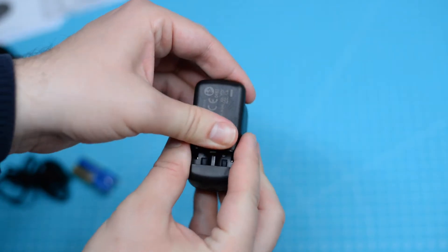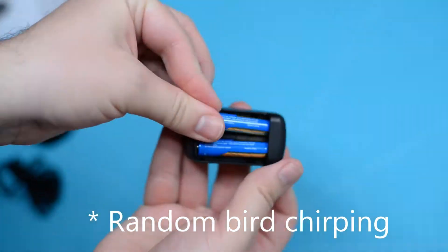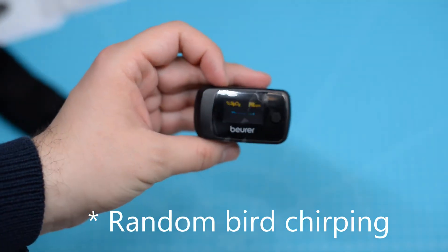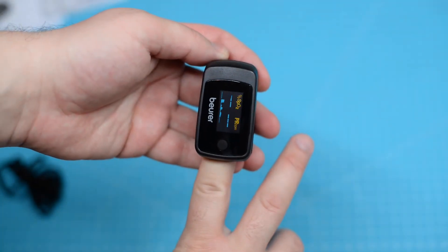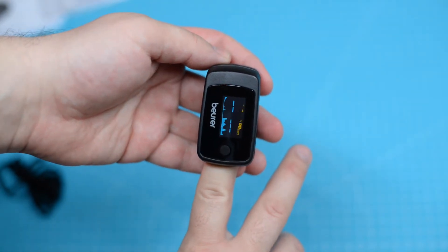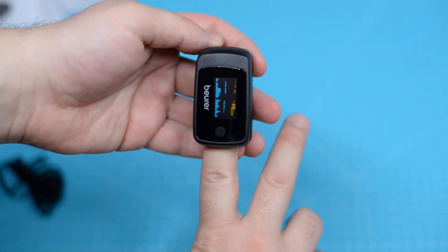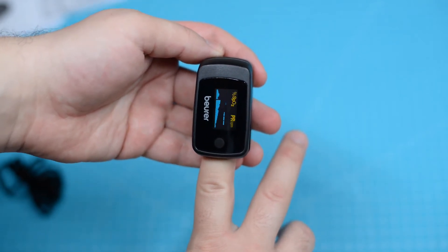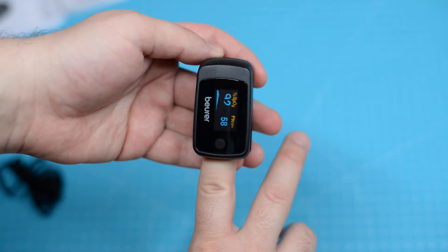We are going to assemble it by adding the batteries. And now we can start the measuring. And that's how not to use it.